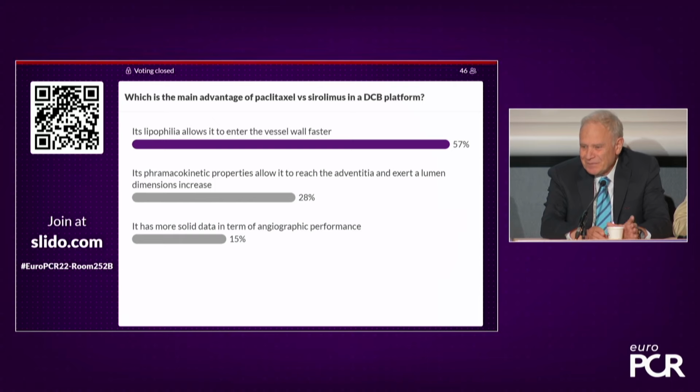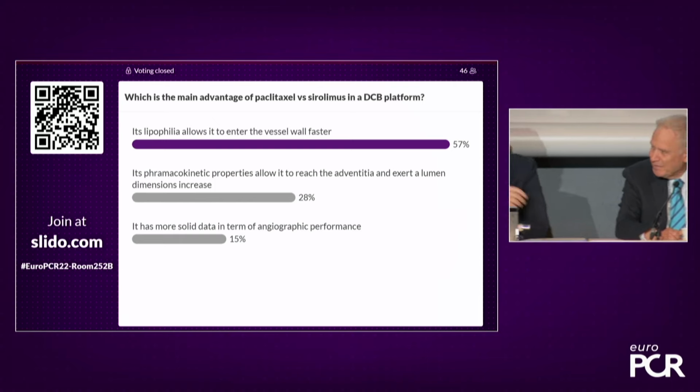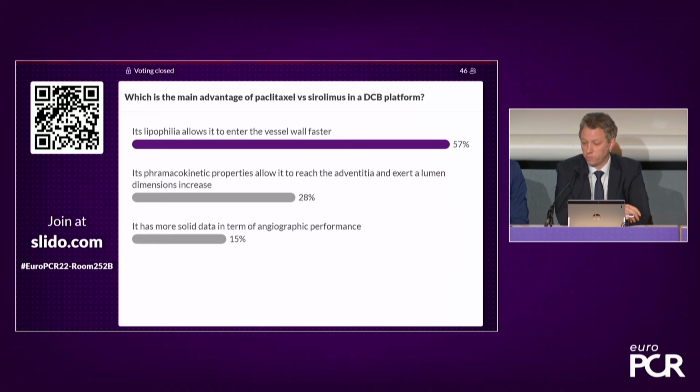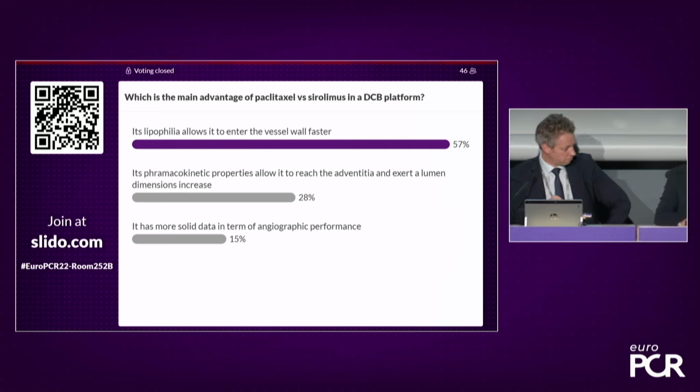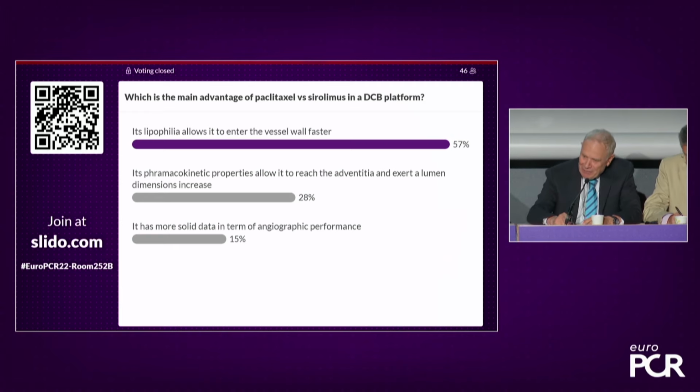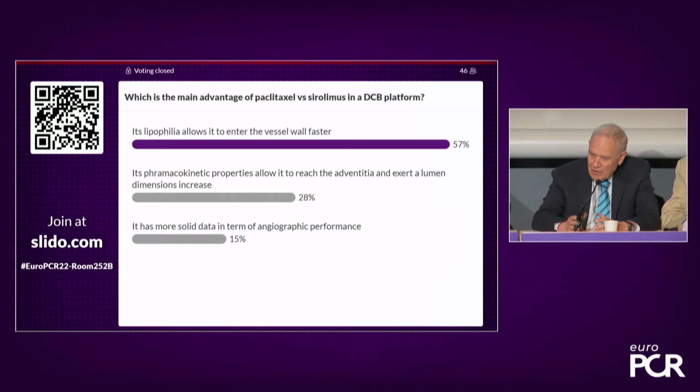I think you could make a case for each of them to one extent or another, and the distribution throughout the vessel wall, like you allude to, there is data behind that, and whether or not that's behind the positive remodeling, possibly it is. In terms of the data that's available, it is probably stronger at the moment with Paclitaxel. I would maybe say that we cannot look at this as a simple question because it's not about just the drug. You cannot just dip the balloon in a Paclitaxel solution and say, I have a drug-coated balloon. There are a lot of other components to take into consideration. But the lipophilic aspect over sirolimus is known, and I think it's probably the majority of the answer to this question.